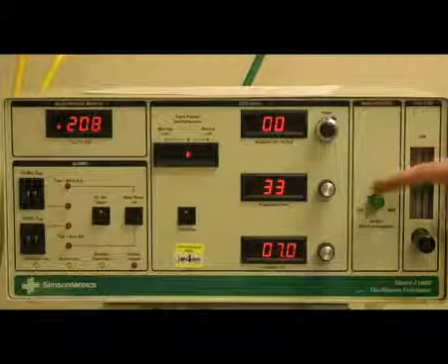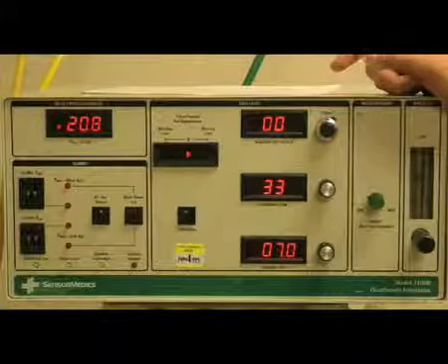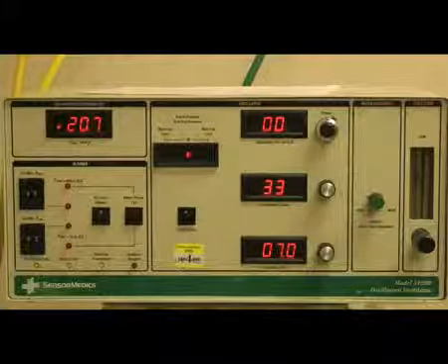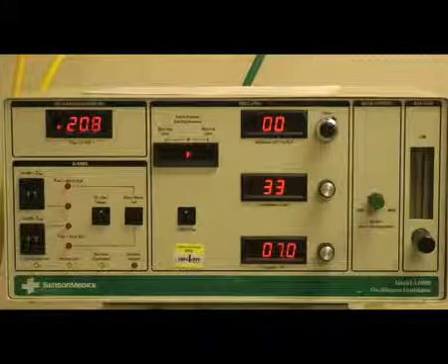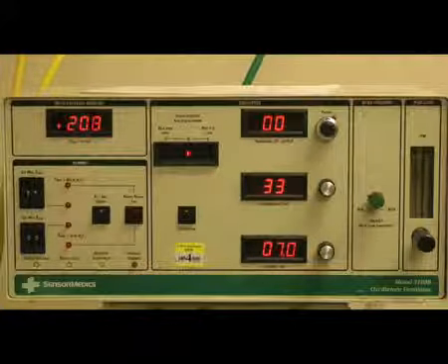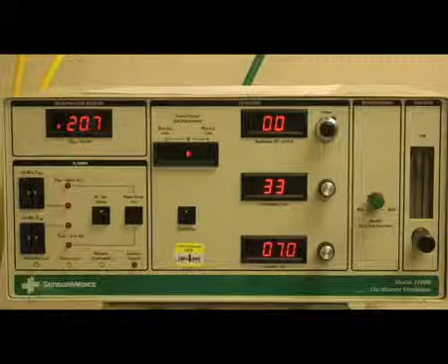You'll want to achieve this mean airway pressure of 45 over a 10-second period. You'll then maintain 45 centimeters of water pressure for 45 seconds. After 45 seconds, you need to reduce your mean airway pressure back to your initial setting of 34 and reset your high mean airway pressure alarm to 40 centimeters of water pressure.